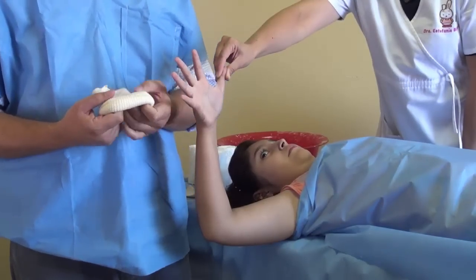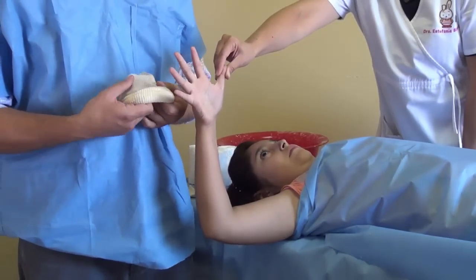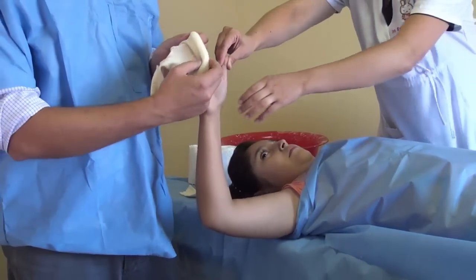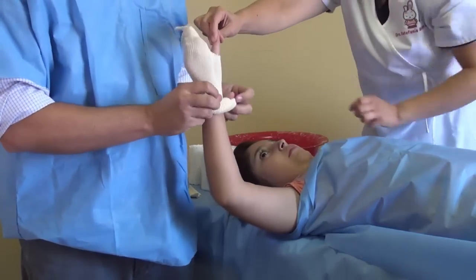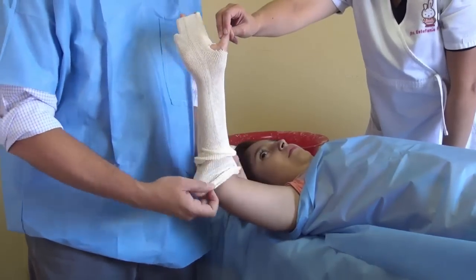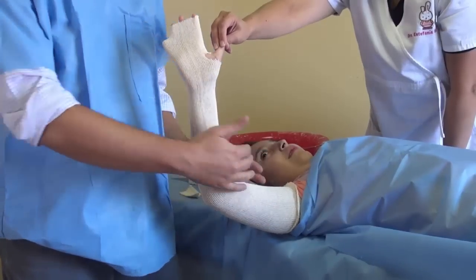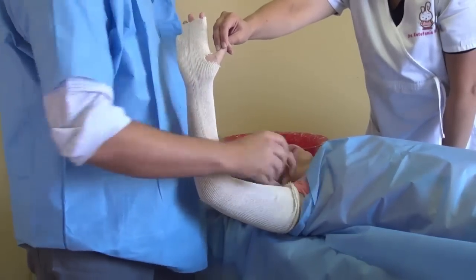First thing we're going to do is unwind the protective stocking. We had already cut a little hole for the thumb, so we're going to put this right here. Now we're going to roll it down. Make sure that it goes all the way up because when you put the cast, it comes down a bit. So try to make it all the way up to the shoulder.